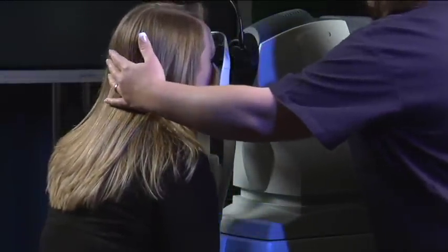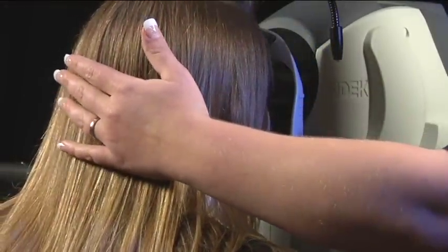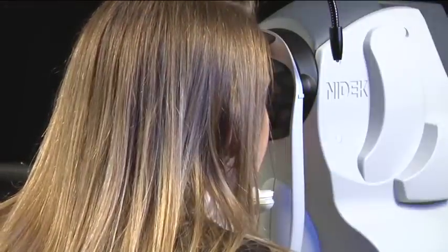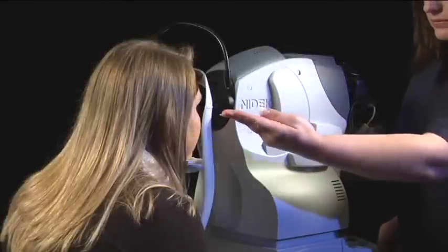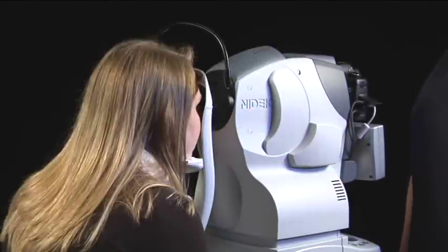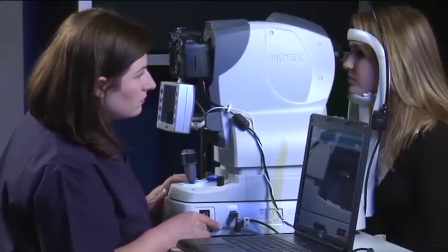When you're ready to take a retinal image, the patient will place their chin on the chin rest and lean the forehead up to the band. You should adjust the motorized chin rest by moving the up and down buttons on the left side of the joystick panel on the AFC. The outer edge of the eye should be lined up with the notch on the headrest. Also, you should adjust the motorized table up or down to accommodate the patient's height. The buttons to move the table are located by the operator's knees.